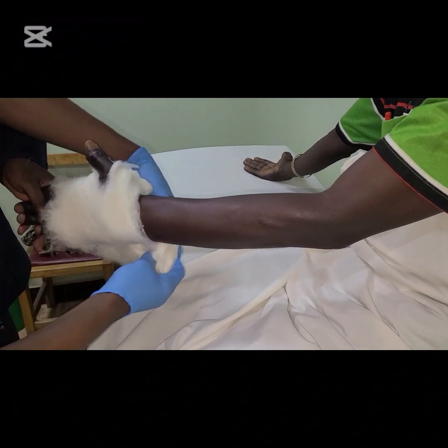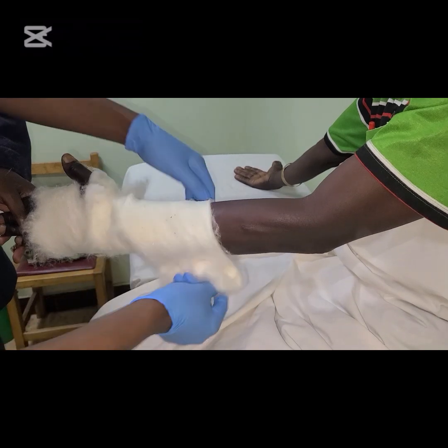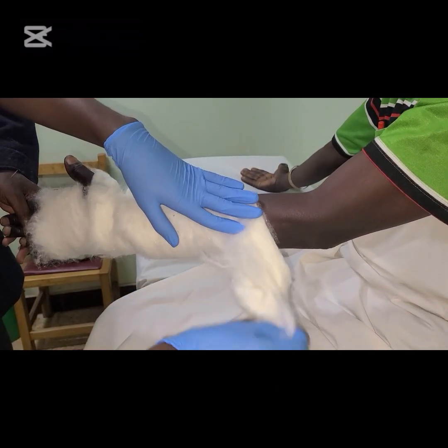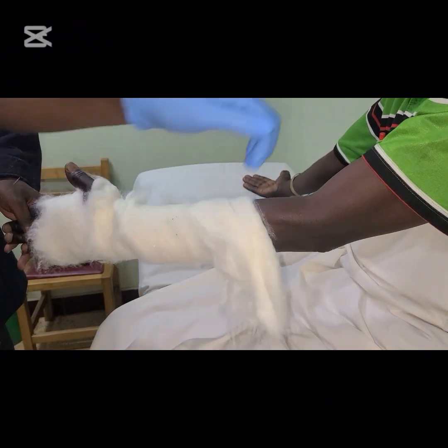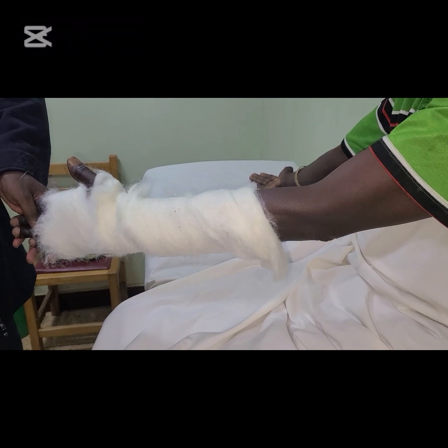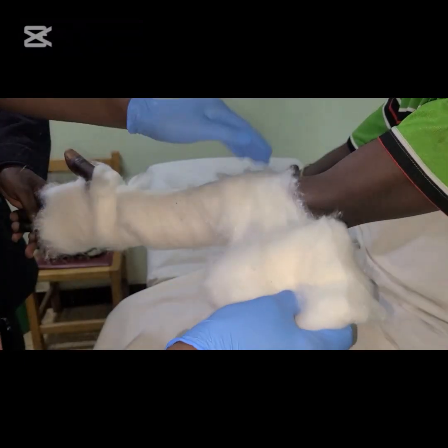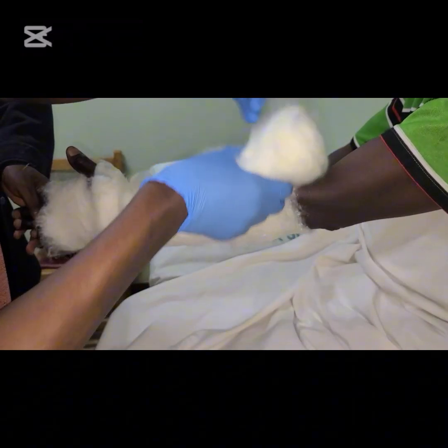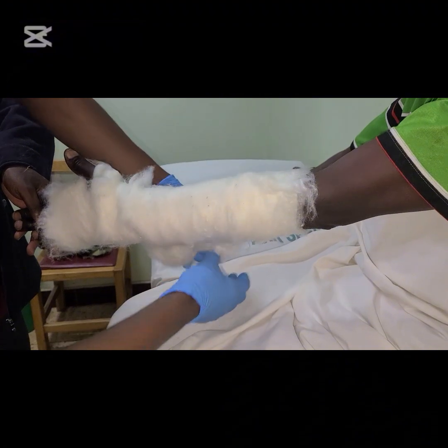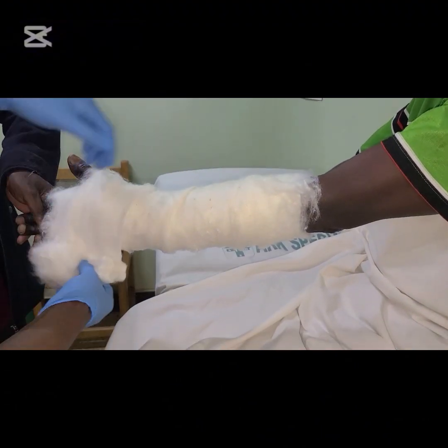Then these are some of the pictures taken during the process of cast application. Remember, you position the limb, then of course make sure the skin is clean and dry. Then you go on applying that cotton depending on which type of cotton or which quality of cotton you have. Then after that, you go on step by step applying your POP bandage as you mold it, in a good fashion, so that it can take the shape of the limb which you want to maintain.